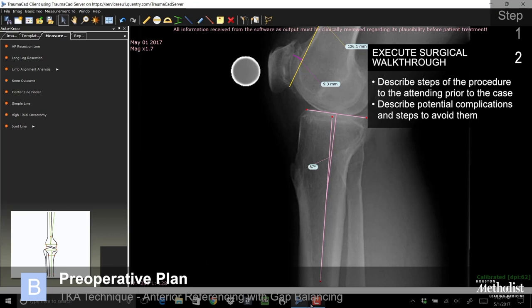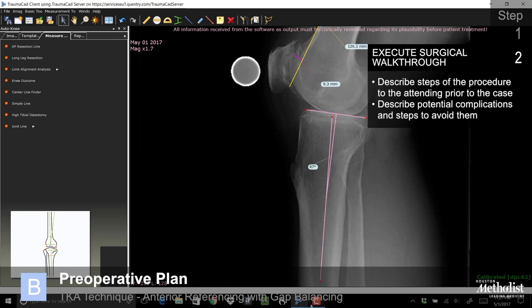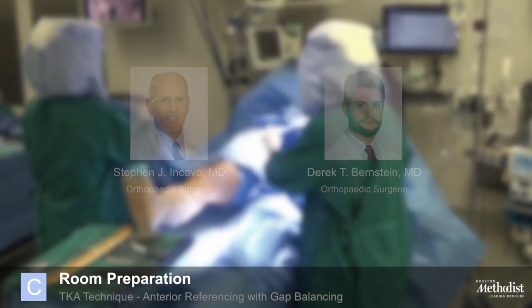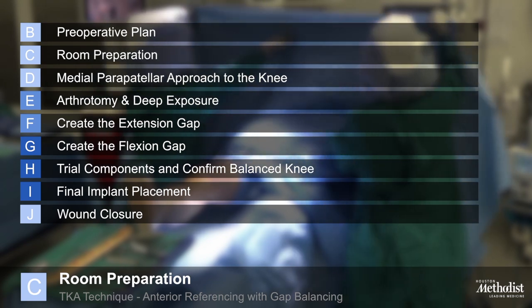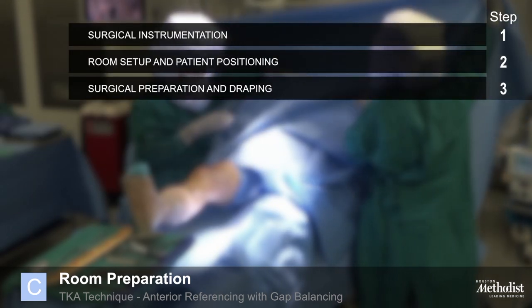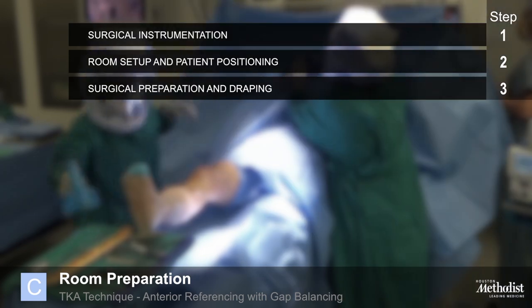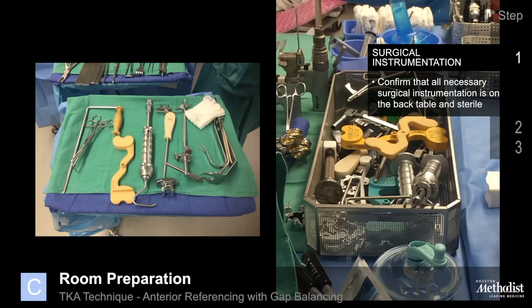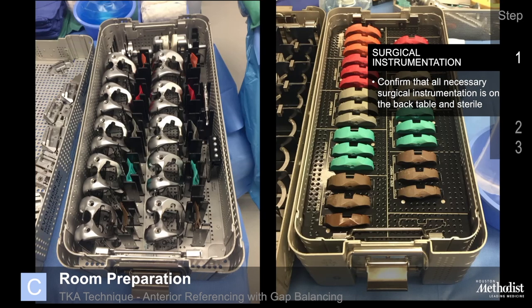Describe the steps of the procedure to the attending prior to the case. Describe potential complications and steps to avoid them. Confirm that all necessary surgical instrumentation is on the back table and sterile.